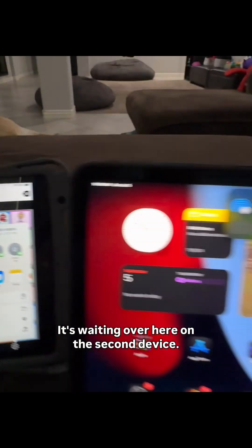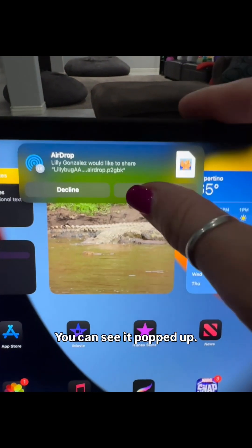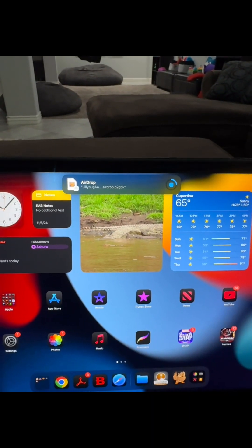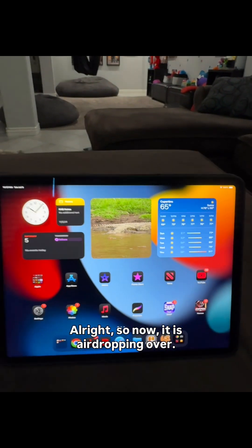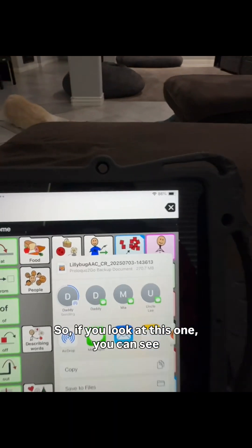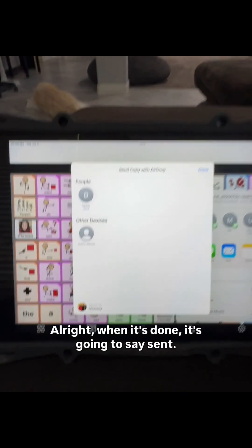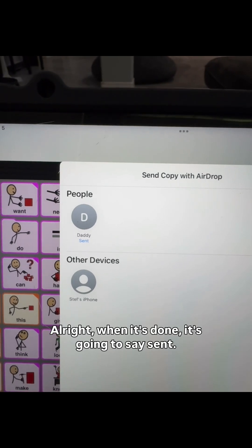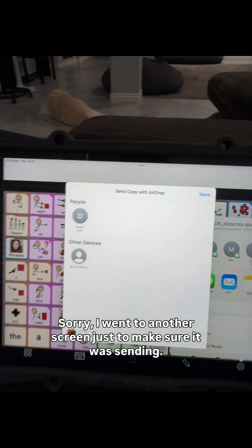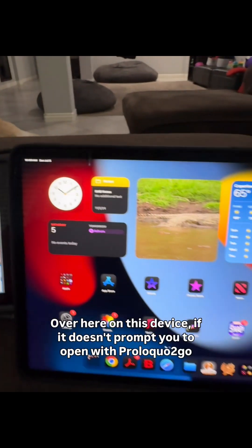It's waiting over here on the second device — you can see it popped up. I'm going to hit Accept. So now it is AirDropping over. If you look at this one, you can see the status. When it's done, it's going to say Sent. I went to another screen just to make sure it was sending. So now we're done with this device.